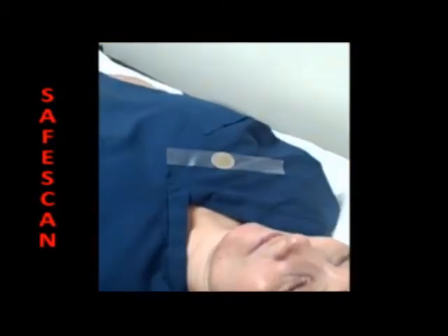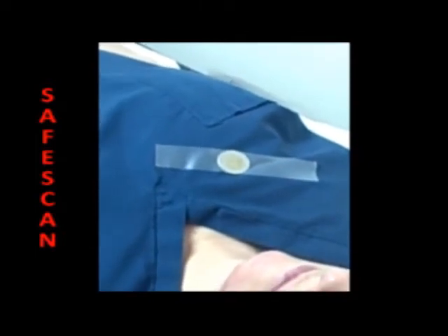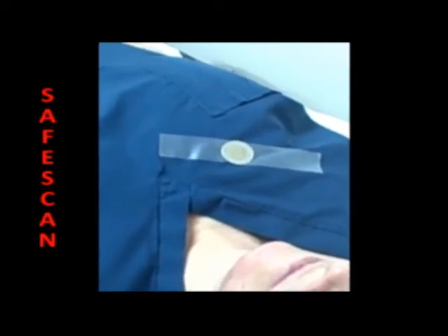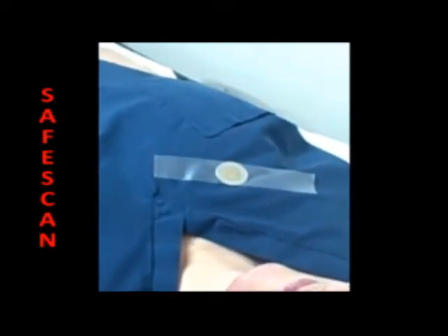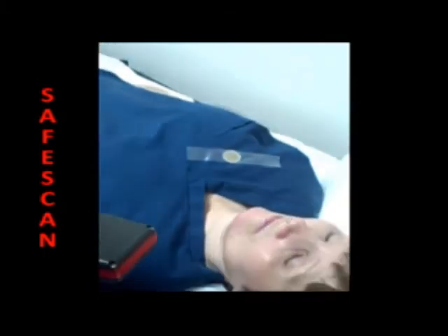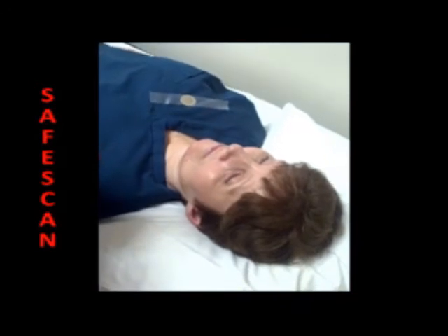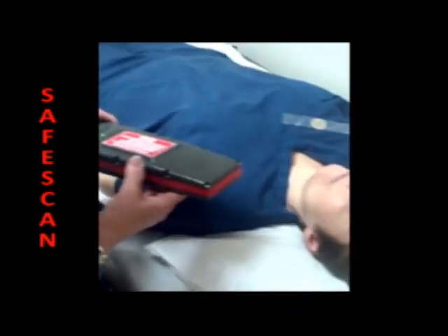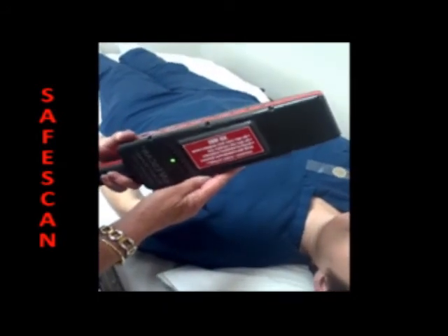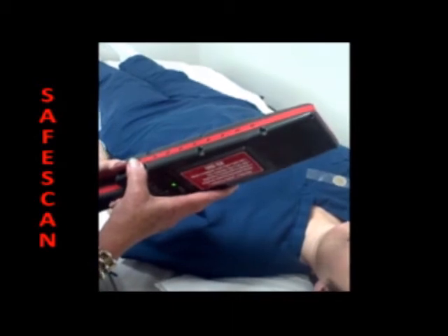Here we have a Canadian coin which is ferromagnetic. U.S. currency is generally not ferromagnetic, by the way. It is not problematic to scan the chest area for 5 to 10 seconds, but when you do this, do it after you've already cleared the patient to enter the huge field of the MRI magnet. The field of the SafeScan target scanner is non-radiating. It is completely passive. It will not affect imaging quality in any way, neither will it erase credit cards.